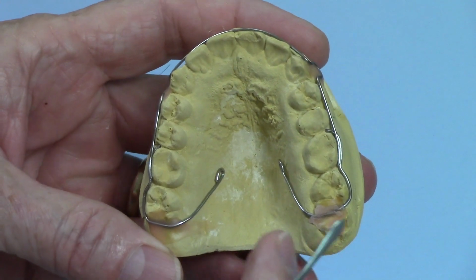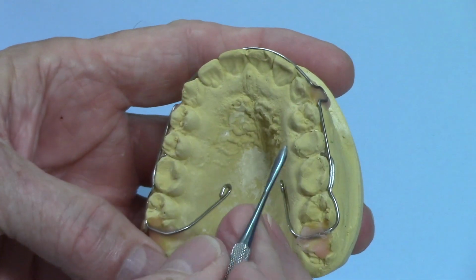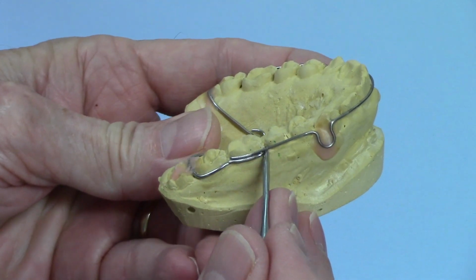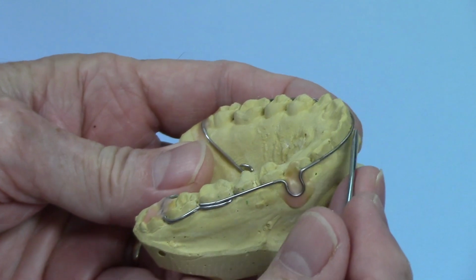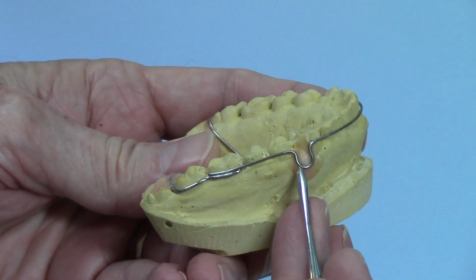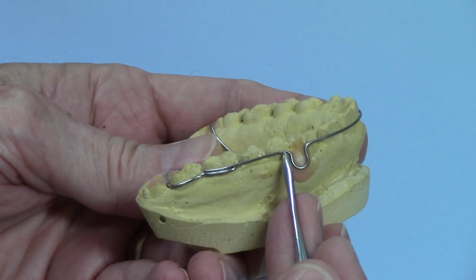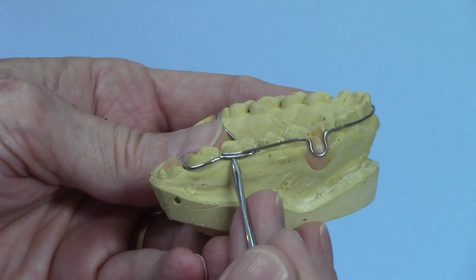Here's a wraparound design that doesn't require wires crossing over the occlusal, not even auxiliary wires up here. It consists of two wires. One is a spring-tempered 036 wire. It's kind of a heavy wire for a labial bow. I mean, you could have the labial bow be 036 all the way around, but it would be pretty hard to adjust up here. And we've made those before. Some doctors like that. But this is just a regular retainer wire. It's an 030. You could use probably an 028 or 032, whatever. This one's an 030, and it's soldered to the 036.